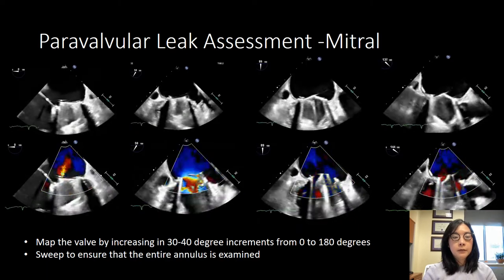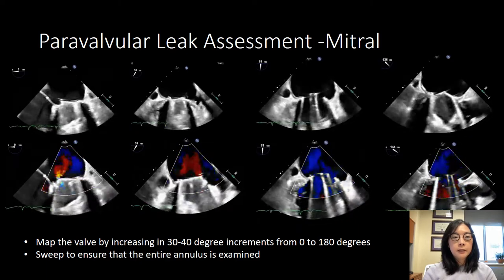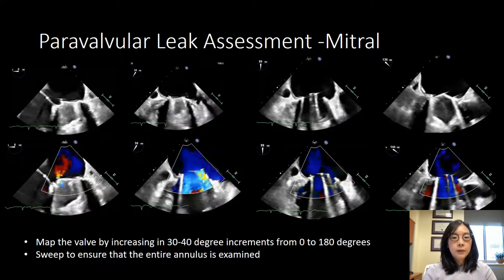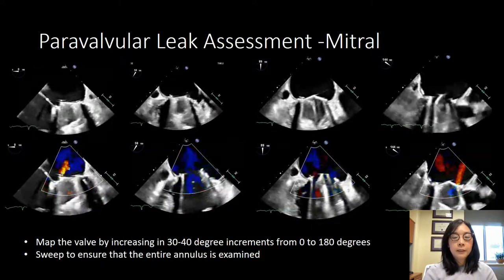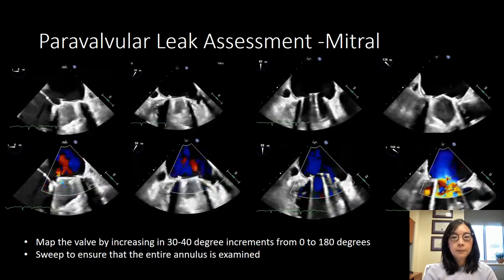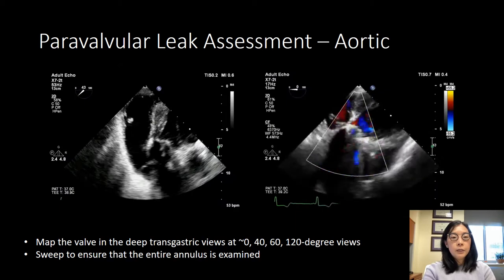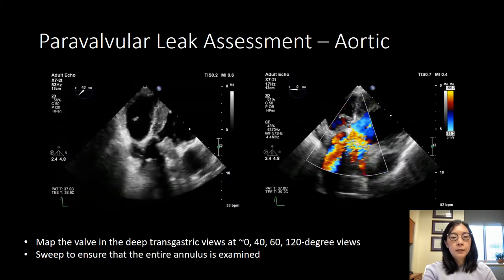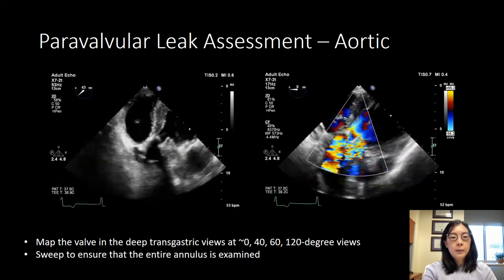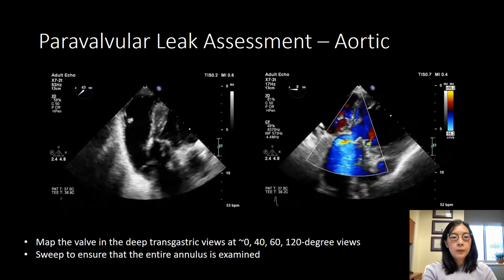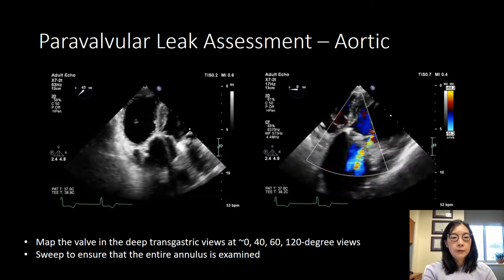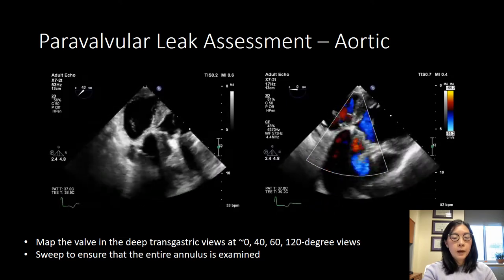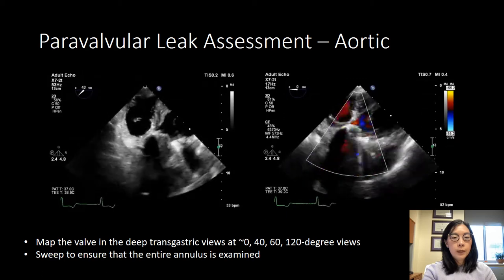Looking at this series of images, this is a mechanical mitral valve. All the leaks are accounted for and so there is no paravalvular leak in this case. For the aortic valve, we typically start in the transgastric views and then we map similarly in 30 to 40 degree increments in order to see the aortic valve in the long axis as well as the short. For both the mitral and aortic valves, you want to be able to see the leaflets.